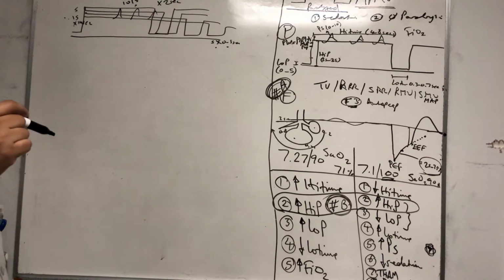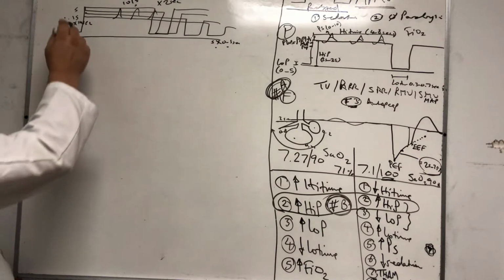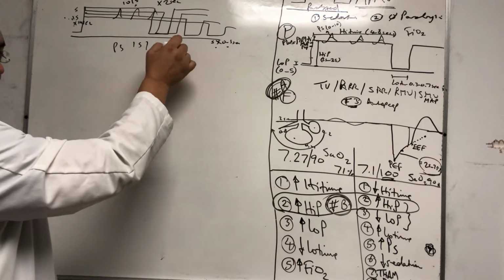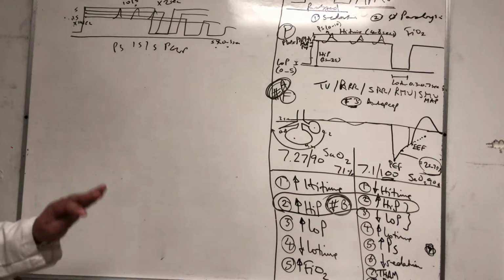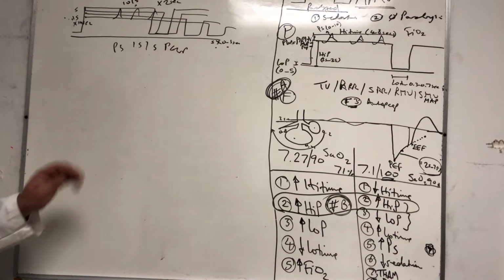So I would say 90% of people will make this mistake. They will say, okay, well, it's 15 and 5, so it's 15 over 5, meaning 15 pressure support and 5 of PEEP. That's wrong. Basically, you took the PEEP from 15. Remember, we said the PEEP is the high pressure. You took the PEEP from 15 and went down to 5 suddenly, right? If you're doing that intentionally because the patient improved, I'm all for it. But if you're doing it idiotically, then you're an idiot. Okay?